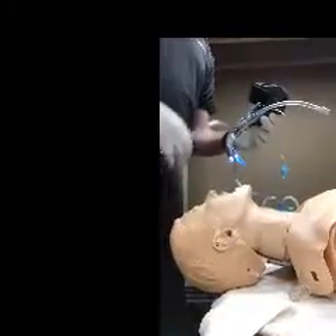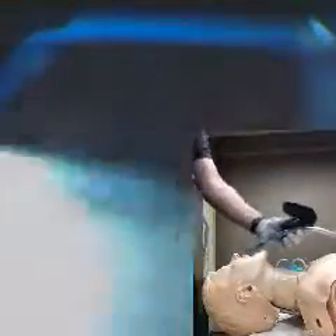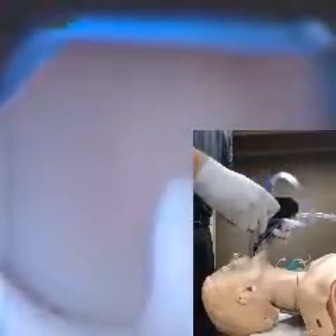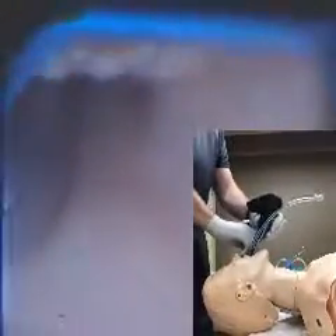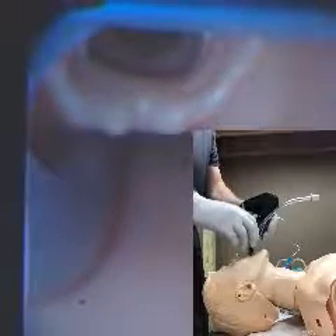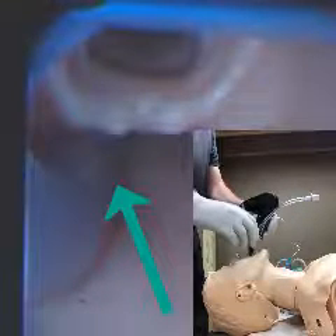We're going to start off here with a two-frame video so you can take a look at an actual intubation of the mannequin. I'm doing this because I want you to understand the importance of suction. You really should have a suction catheter in your right hand anytime you do an intubation, and with the AirTrax it's extremely important. What I'm doing here is putting the suction through — this is kind of a modified SALAD technique. Obviously there's nothing in this airway, but you suction out the airway and then place the suction catheter right into the esophagus in case anything comes up. It's just going to keep your opening clear.